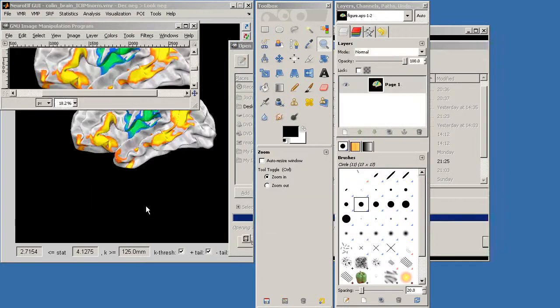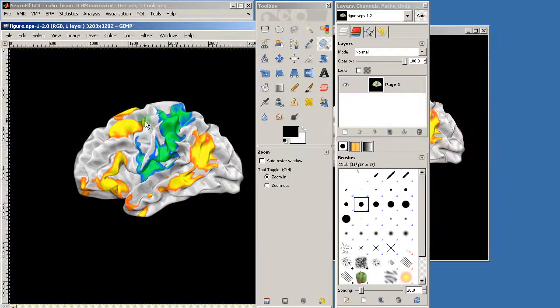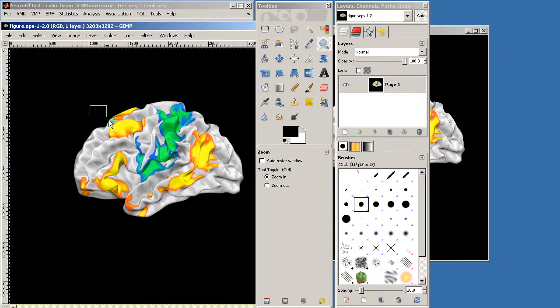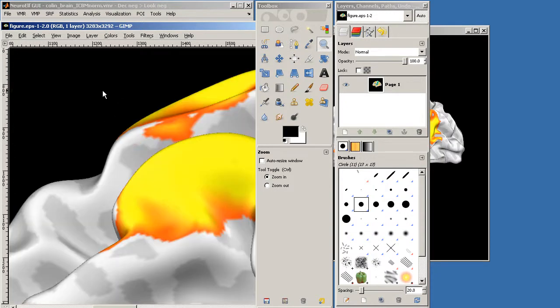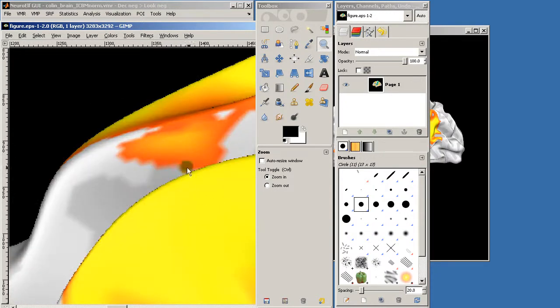So if I now zoom back into roughly the portion that I had before, you can already see that now I need to zoom even further to get this kind of pixely look.